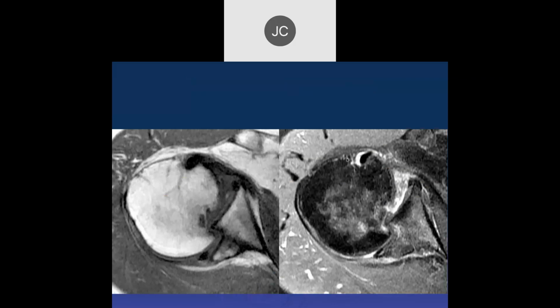And here we've already seen this. Actually, no, this is slightly different from what we've seen before. Go ahead, Pavan. So it looks like, depending on how high up we are, it might be a posterior displacement. Yeah, okay. So this is really a posterior dislocation and impaction, and here we can see that there is a fracture of the glenoid with an impacted fragment here.